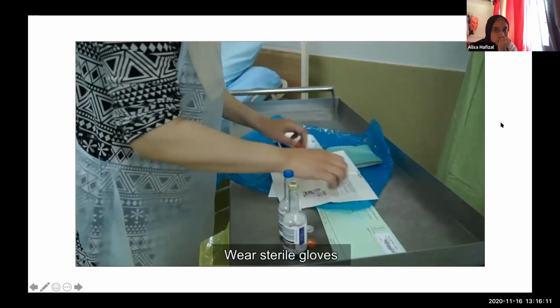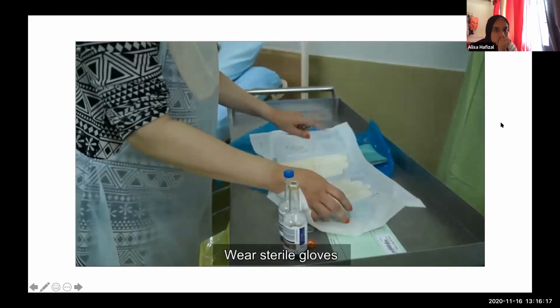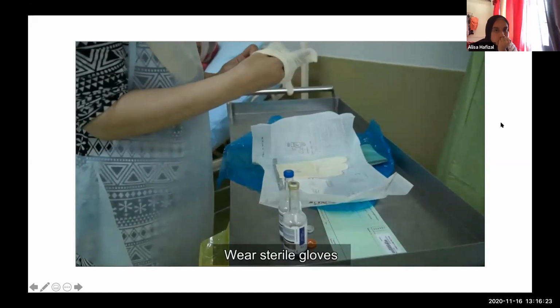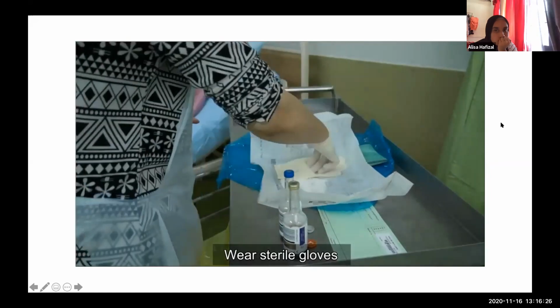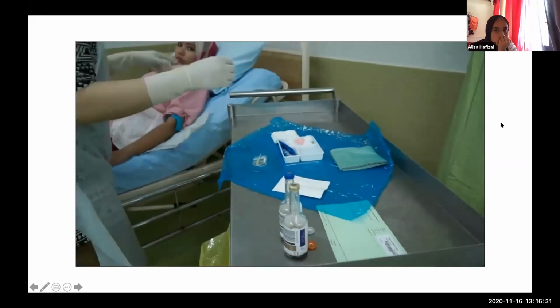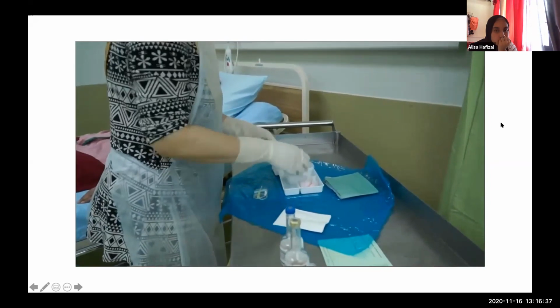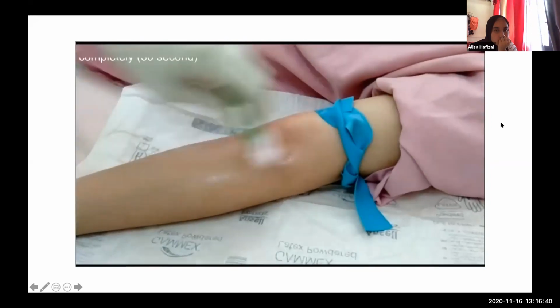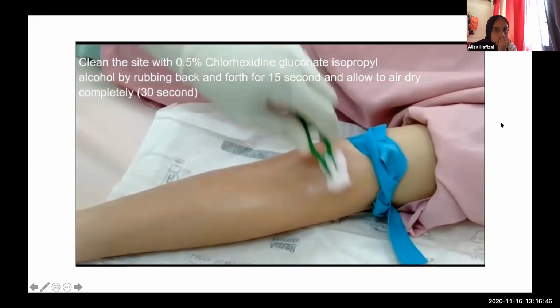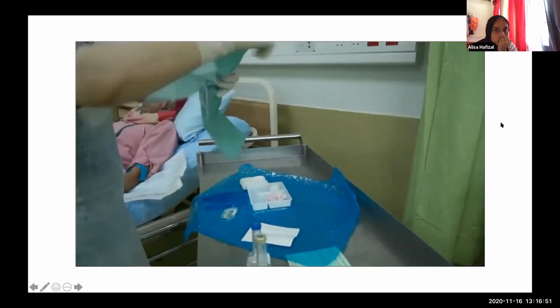Wear the sterile gloves. Use the gauze soaked with antiseptic to sterilize the venipuncture site. Rub antiseptic in to-and-fro motions. Do not palpate the vein again after cleaning the patient's skin. Allow to air dry first.